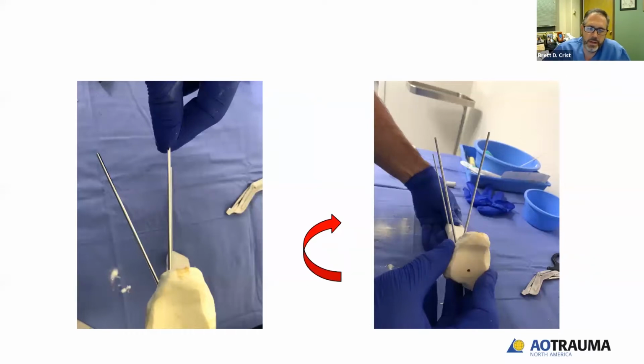Then he talked about an interesting technique using 3 wires instead of 2, because if you're using the triangles with the degrees on it, it is kind of difficult to eyeball it from your point of reference. So if you set up 2 wires distally, one with the amount of correction that you want, say 30 degrees, and the other positioned at the starting point, it's just another plane of reference that parallels the triangle sides. It can also help as another frame of reference instead of necessarily using a goniometer.